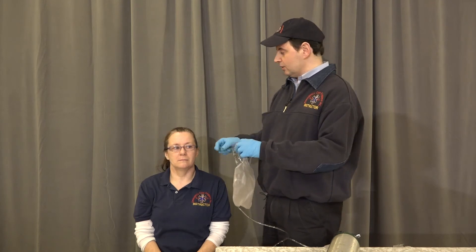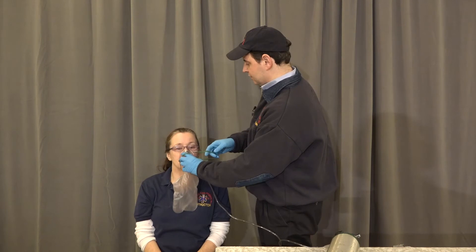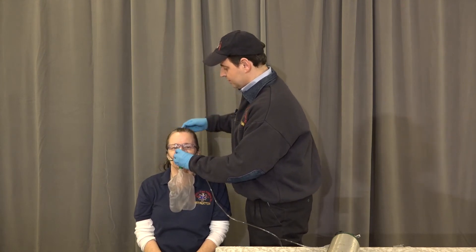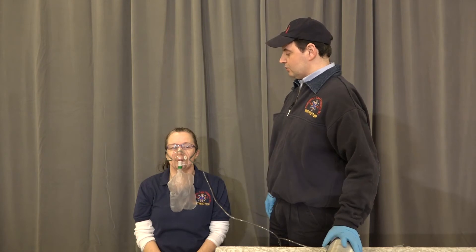Ma'am, we're going to give you some oxygen — I want you to breathe as regularly as possible. We're going to place it over the person, adjust it to the patient's face, pinch it, and we want to always ensure that the bag remains at least one-third full.